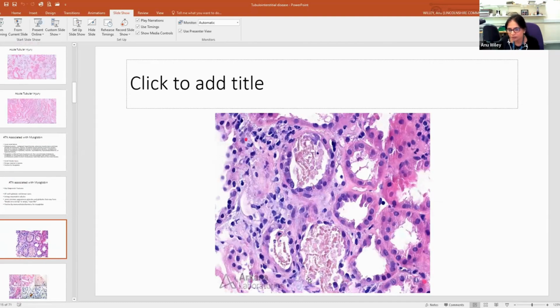You have these tubules, which are showing acute tubular injury, but it is not simple acute tubular injury, because within the tubular lumen you can see they're filled with these bead-like structures, and in places forming strings or a wisp-like, garland-like structure. Quite a few of them look very wispy and ropey, and that is a very typical appearance of a cast produced by myoglobin, or acute tubular injury associated with myoglobinuria.